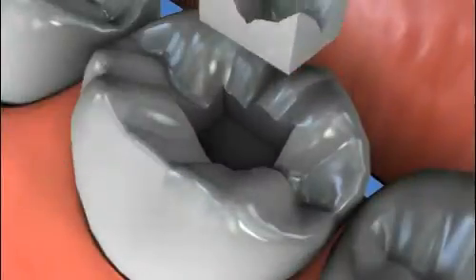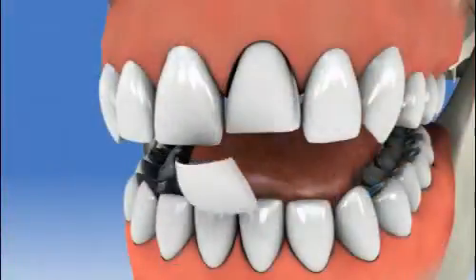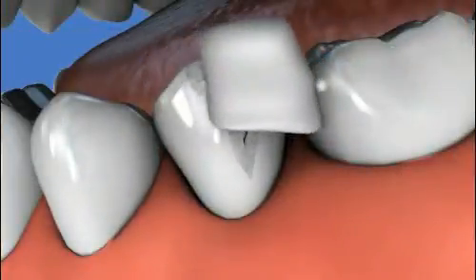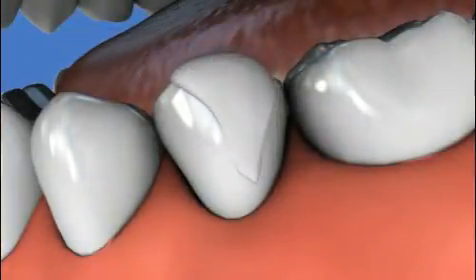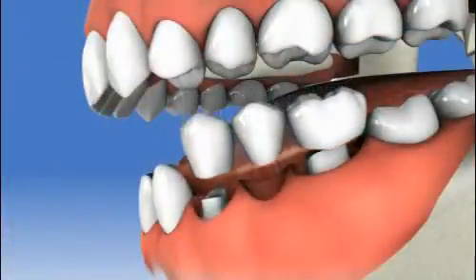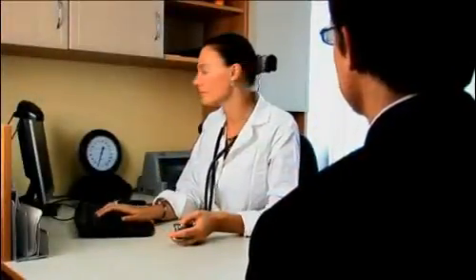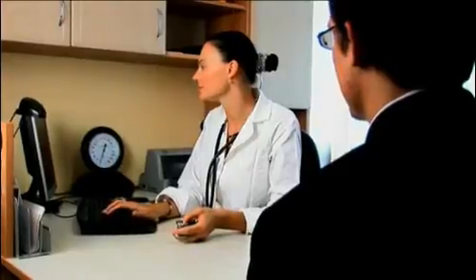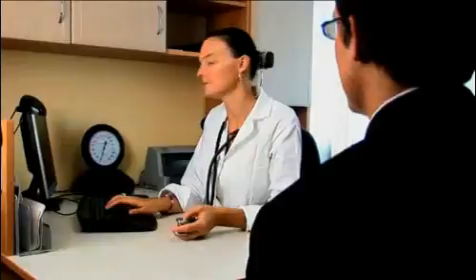Today, your dentist has many options available to repair damaged and decayed teeth. But as natural as these cosmetic restorations can look, they all start with a good foundation, and that often starts with a root canal. A root canal is a very common dental procedure used to avoid extraction of an infected tooth. It is always the goal of your dentist to preserve your natural teeth whenever possible.